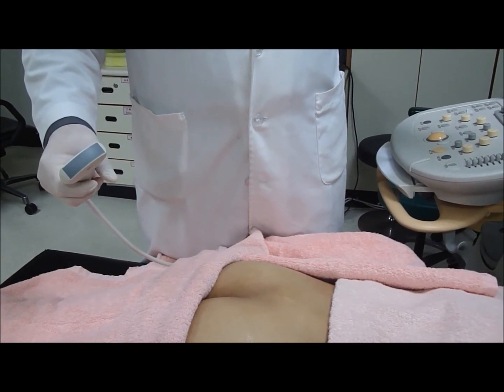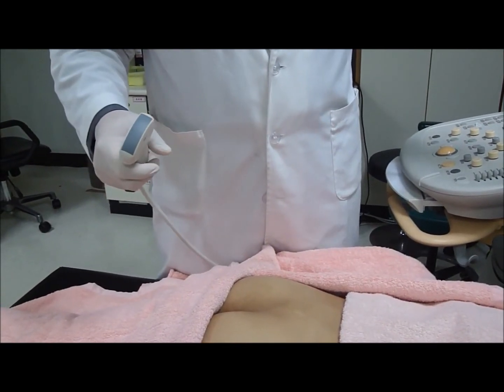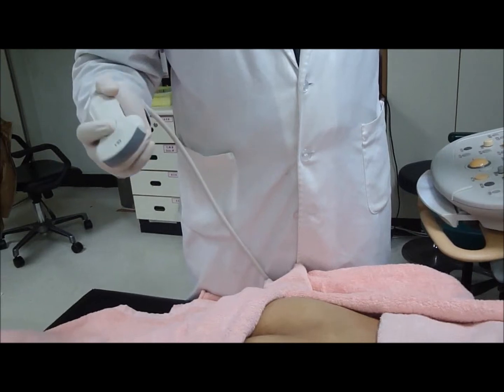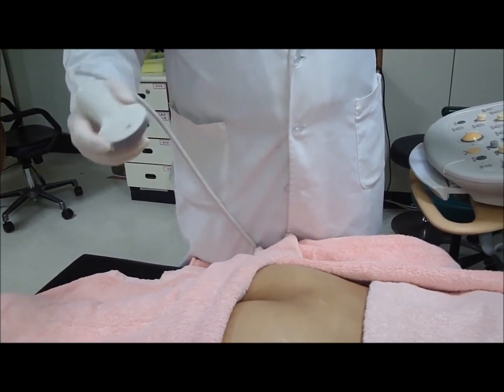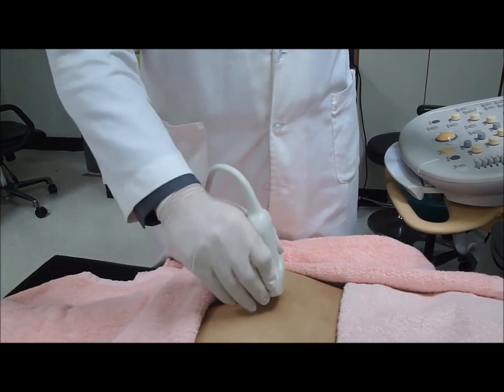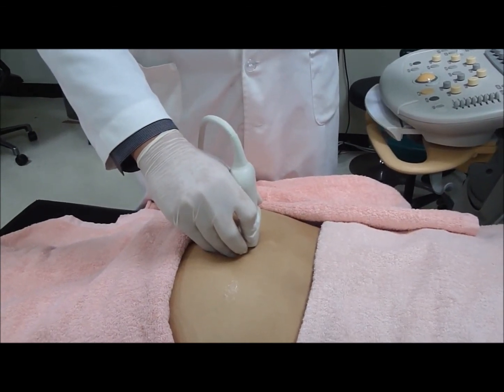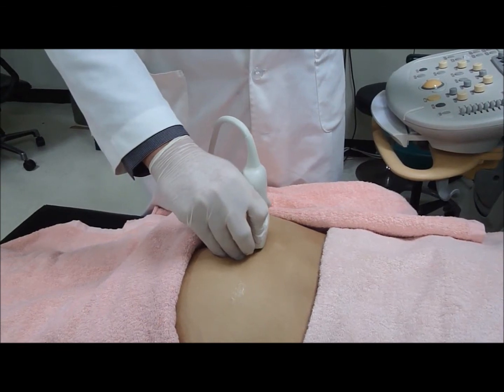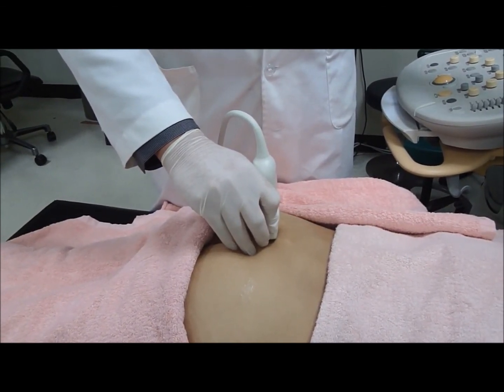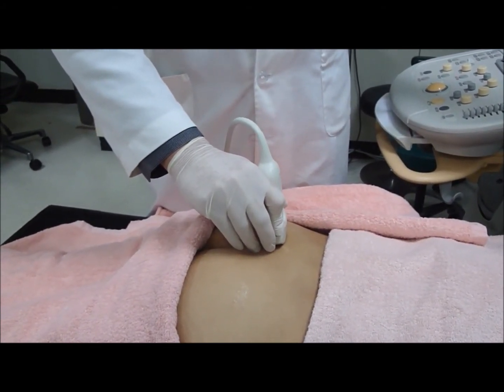Similar to the caudal epidural injection, the patient is in a prone position with extra towels or a pillow positioned in front of the pelvis to increase the pelvic tilt. The probe is positioned in a transverse orientation to identify the sacral hiatus first. After identifying the sacral hiatus, the probe is then moved in a lateral position until the lateral edge of the sacrum is observed. Then the probe is moved in an upward or cephalad direction until you see the sacroiliac joint.